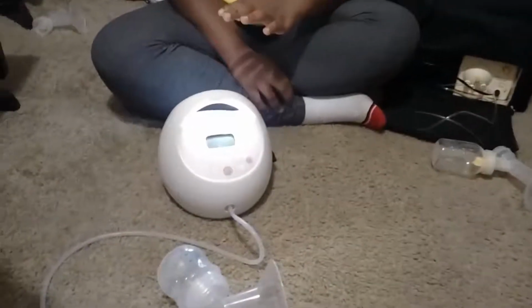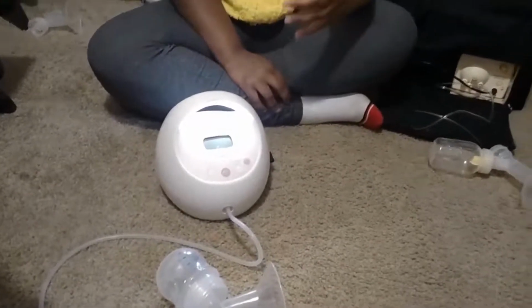I didn't have this at first when I first started pumping, so when I would do my midnight pumpings, I would have to leave the room because I didn't want to wake everybody by turning on the lights, and I couldn't see the pump to actually adjust the dial and do everything I needed to do with it anyways. So I would just leave the room, do my business. Plus the pump was super loud, so I didn't want to wake anybody.